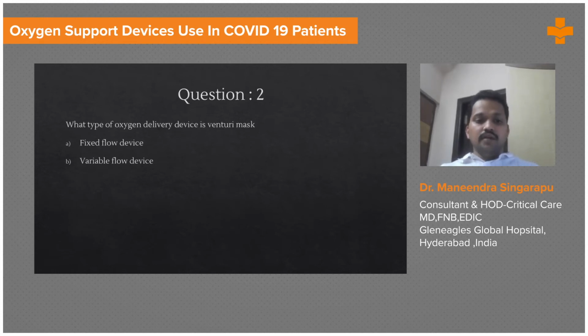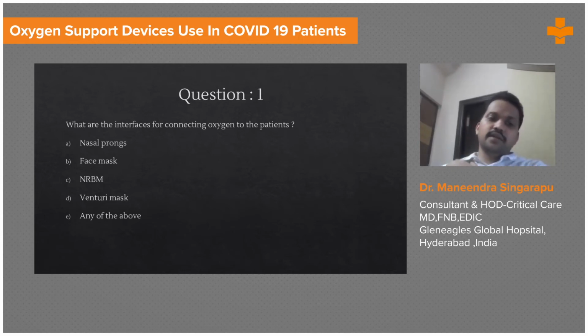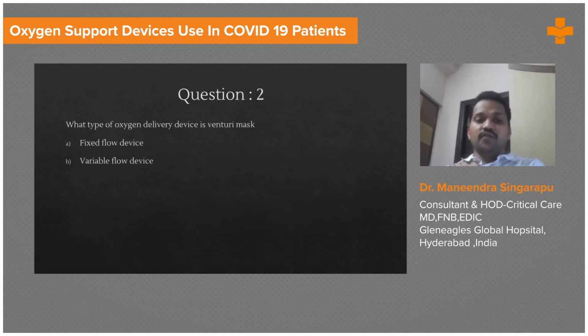So in this, nasal prongs, face mask, non-rebreathing mask, Venturi mask. So what is a Venturi mask? I think most of you will be knowing about nasal prongs, face mask, and non-rebreathing mask. But what is a Venturi mask? So Venturi mask is a fixed flow device.